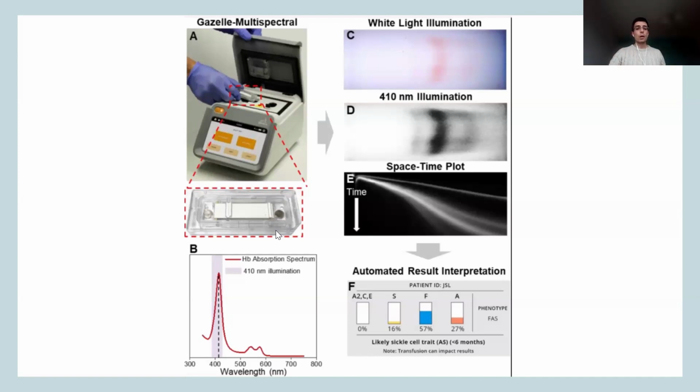Being semi-automated, there is still a component that you need to do manually, which is pipetting the sample and the buffer, so the anode and the cathode can work. There are timings involved as well, which we noticed are quite critical. The analyzer itself is set up with a timer, which is a nice addition. Once you pipette a stage, it will start a countdown for you to carry on the procedure, minimizing errors and helping you not to add the reagent where you shouldn't.